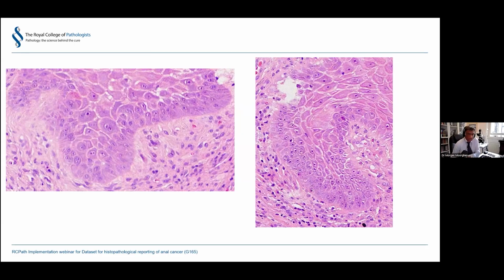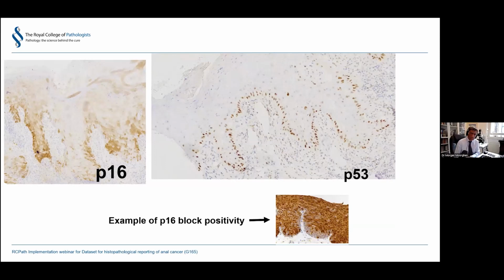But you've got to be very careful because, of course, that merges with what in fact may be a reactive phenomenon. And this is where the problem lies. That's where p53 comes and helps you. But there will be cases where your p53 will be negative, and we'll come to that in a minute.